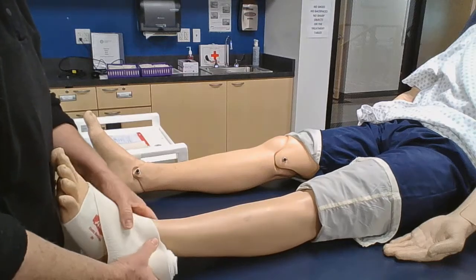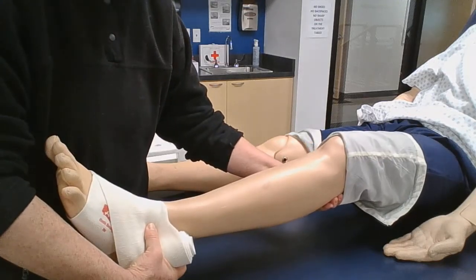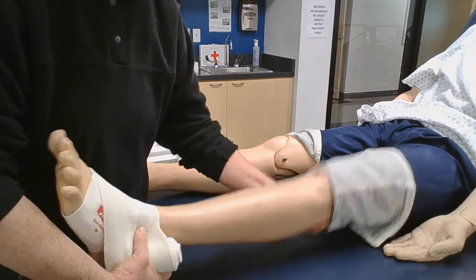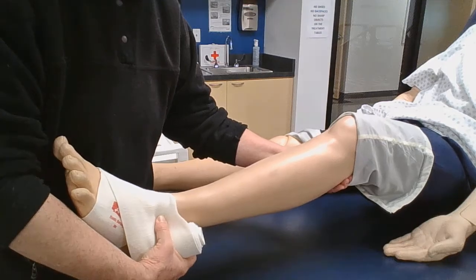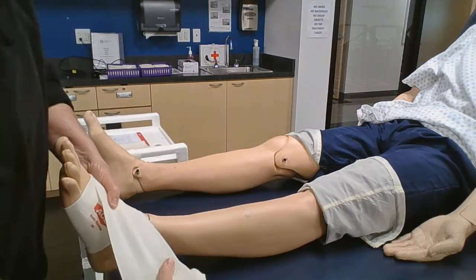You can do it down here. What I don't like people to put bolsters here. Why is that? Because when you put a bolster here, you're impeding the flow of his venous return and his lymphatics, right? Okay. All right.